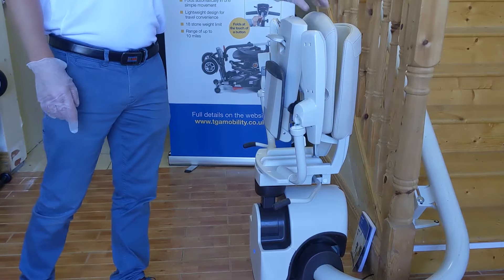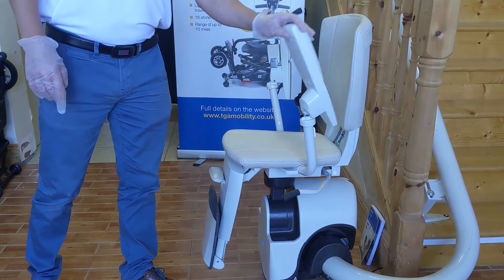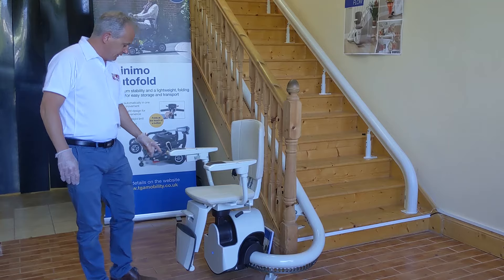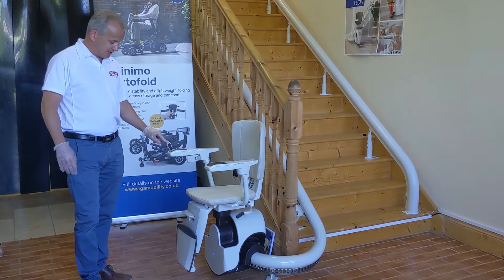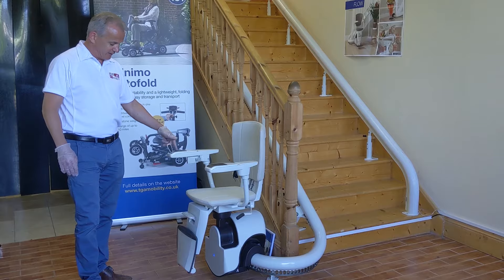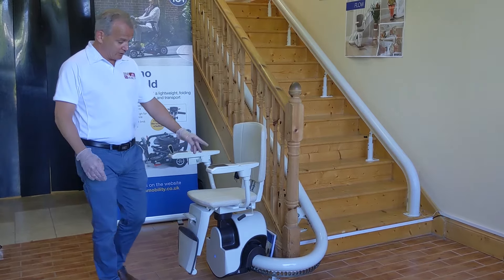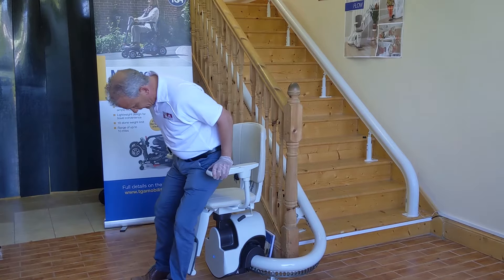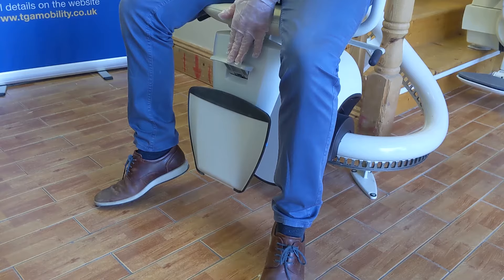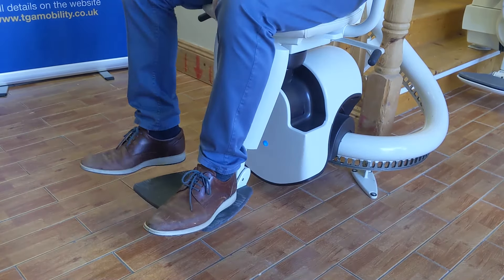It has the seat and footrest interlinked, so once you push down the seat the footrest comes with it, and the two arms just pop down like so. The joystick on this is a good size — about two and a half to three inches — so you can use the palm of your hand or your finger. I'm going to pop into the stairlift now: you sit into the seat and on this particular chair you push down the foot plate and it goes ahead.